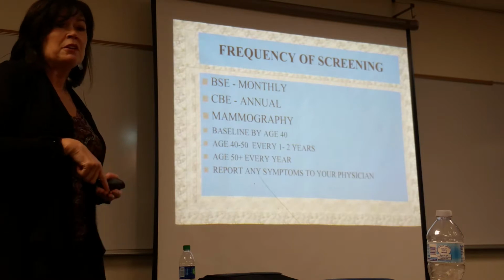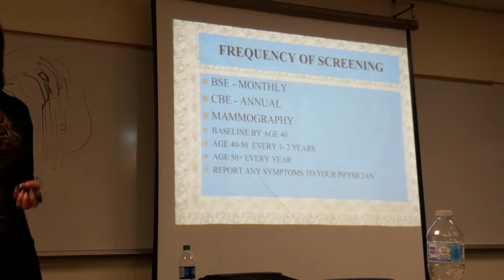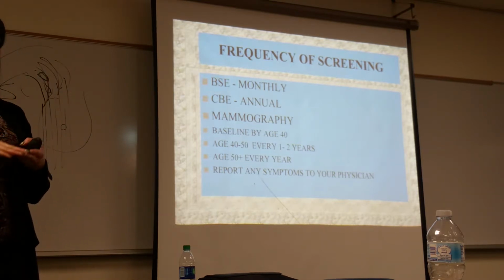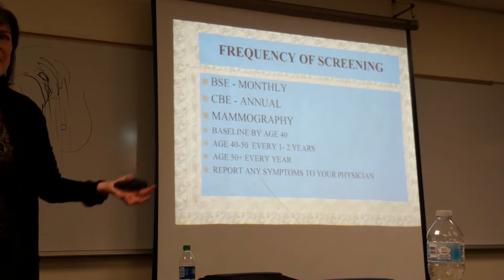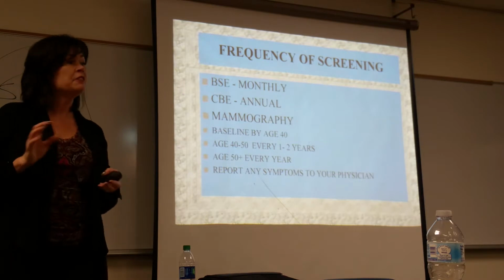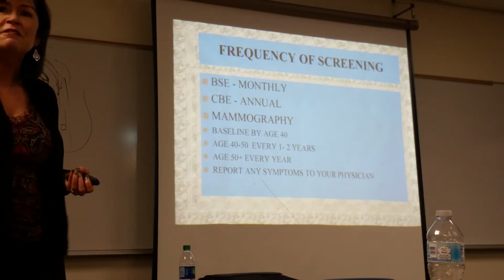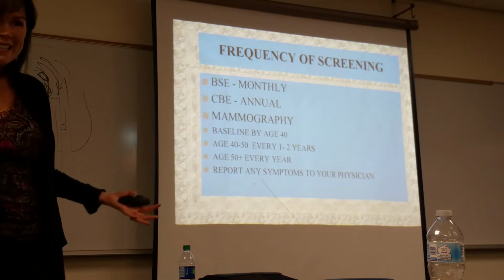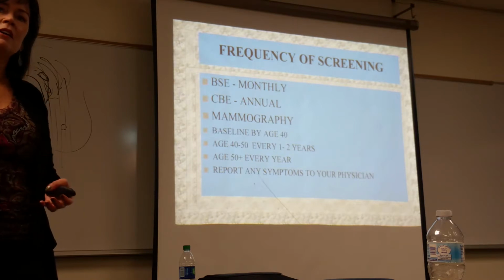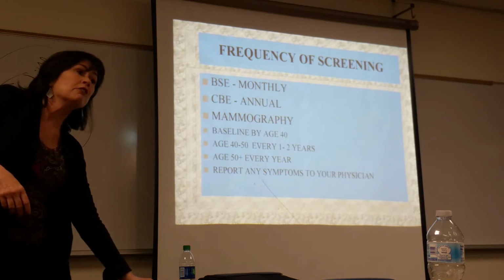I compare that to before, even, I worked with it a little bit, but remember those cardboard cassettes that we worked with? Oh, you don't. You showed it to us. Okay, they didn't use it. That's right, I forget. We did a finger or a hand, and it was like 150 mAs. What I meant by a cardboard cassette is we didn't have screens, so we just used direct radiation to image a hand, and it was 150 mAs. What do you use for a hand x-ray now, mAs-wise? One mAs.